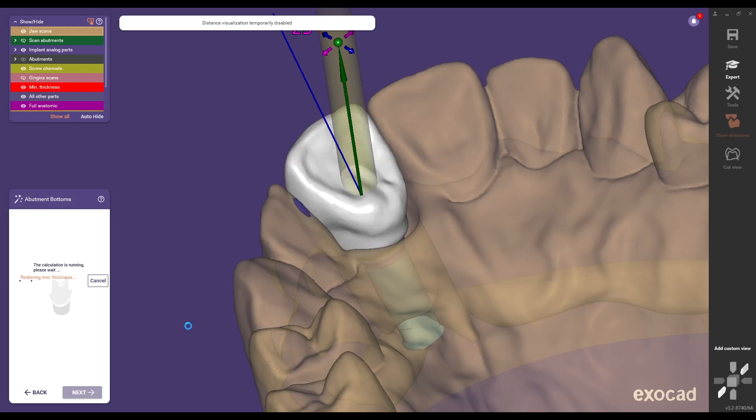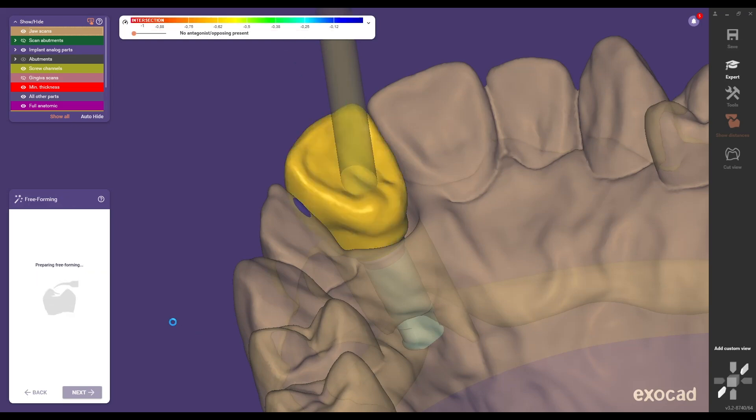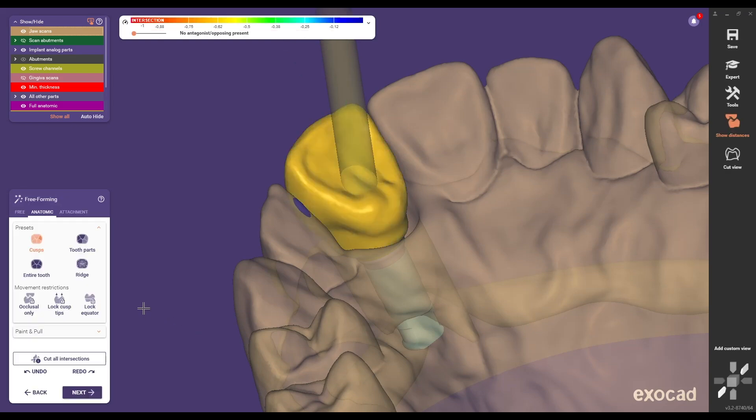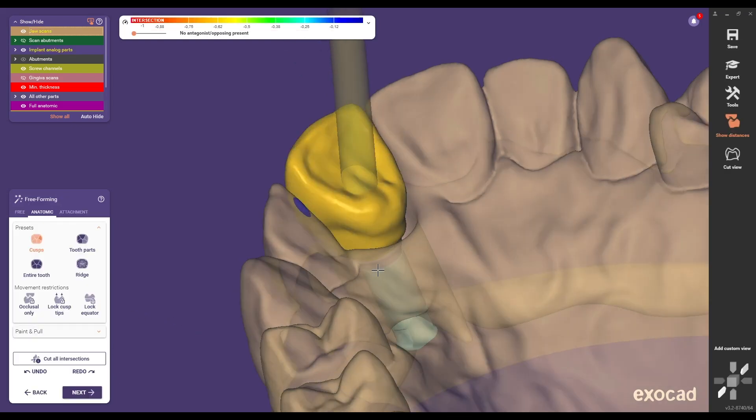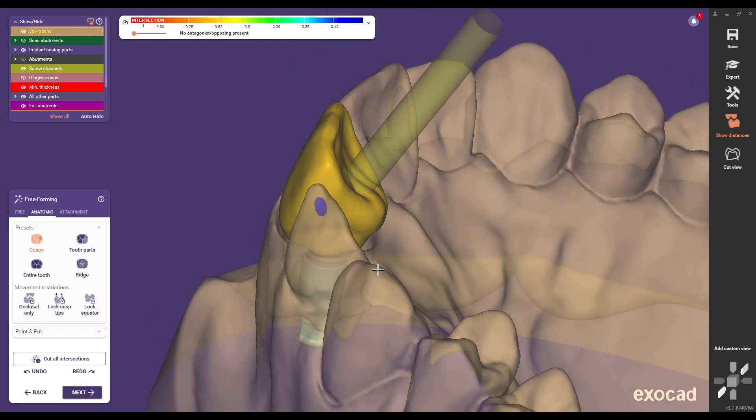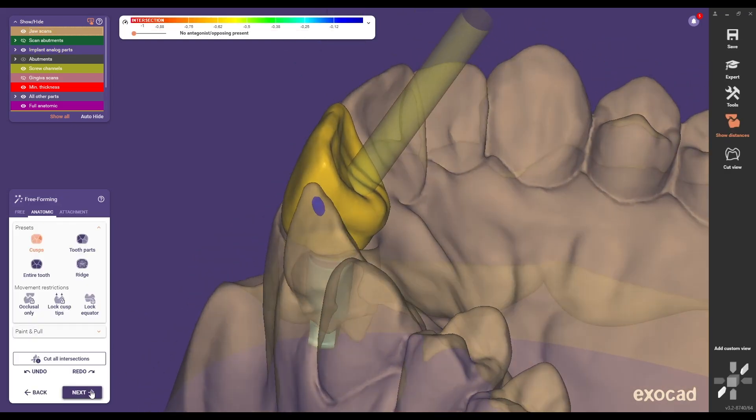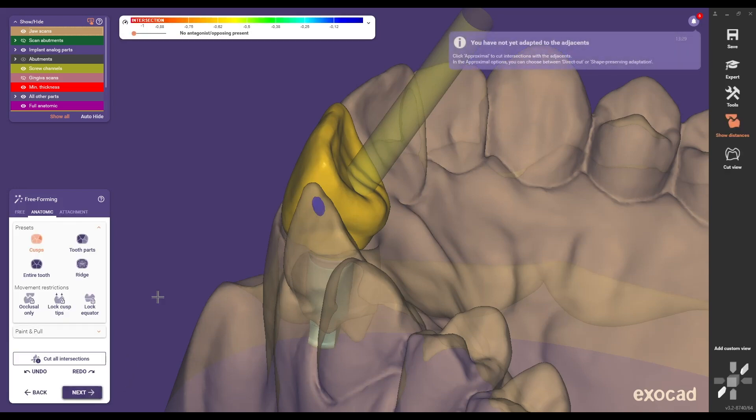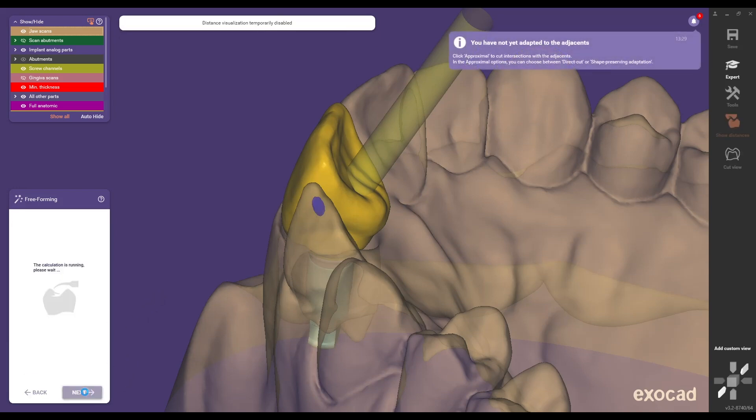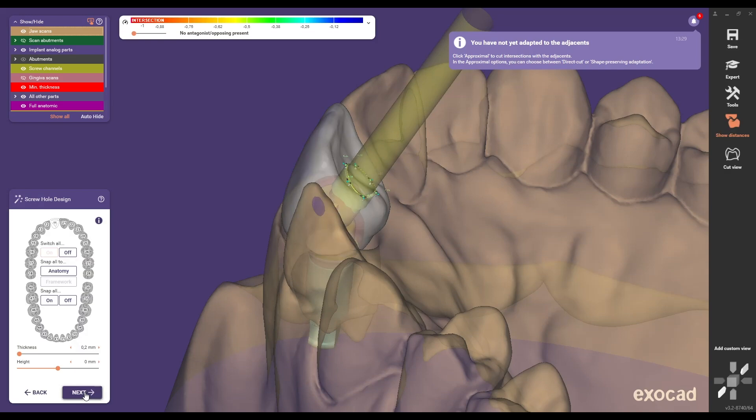After aligning the screw channel correctly continue with the remaining steps as usual. We hope you enjoy designing your construction with the new feature of ExoCAD Elefcina 3.2 on the titanium base ASC Flex from Medentica.